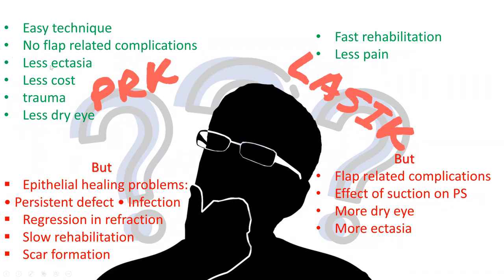Less ectasia, so the PRK will be more favorable for the biomechanics of the cornea. So less incidence of ectasia after PRK. Less cost because the patient shouldn't incur the cost of the microkeratome and the blades.